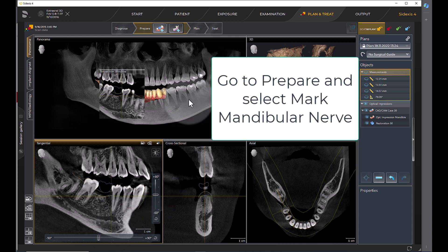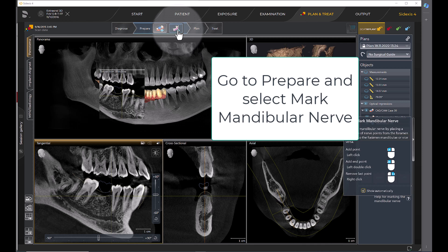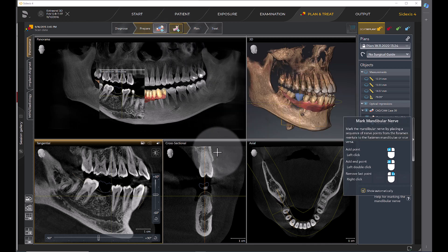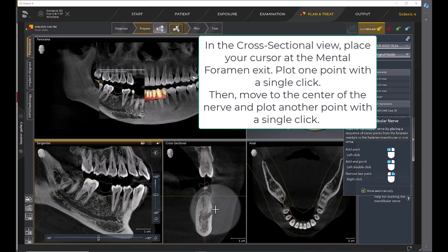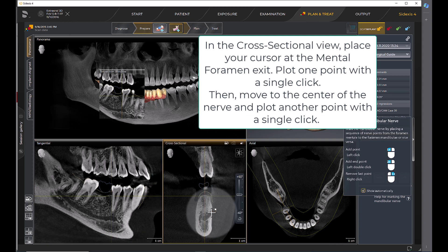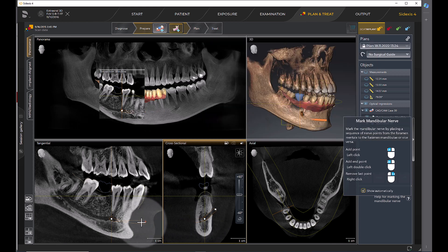Go to Prepare and select Mark Mandibular Nerve. In the cross-sectional view, place your cursor at the mental foramen exit. Plot one point with a single click. Then move to the center of the nerve and plot another point with a single click.